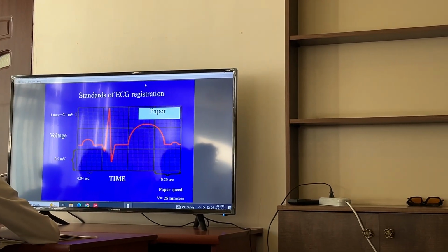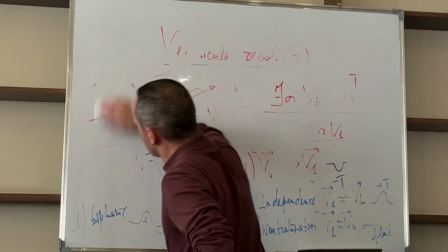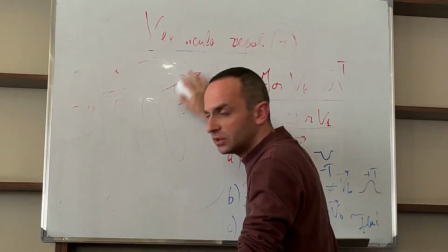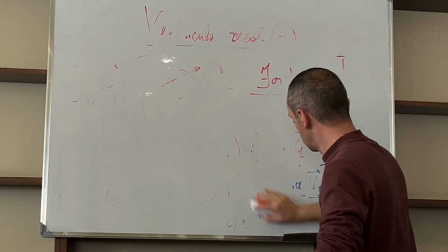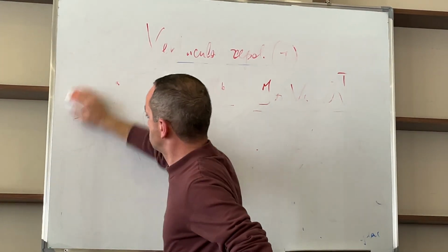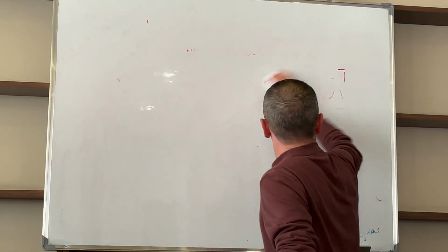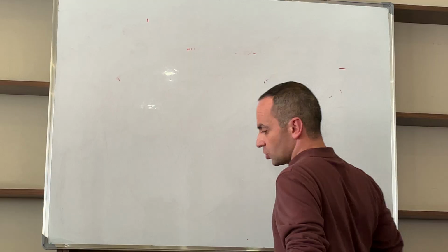Now look, I said that we may measure in millimeters or in millivolts. But millivolt or volt is the difference of potentials, delta phi. How did it become a length measurement? It is coming from calculation.